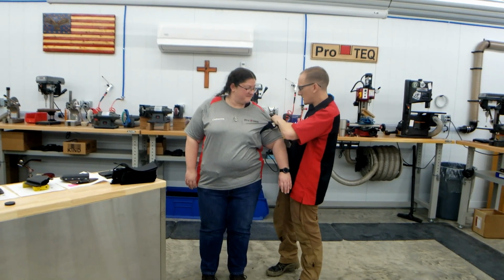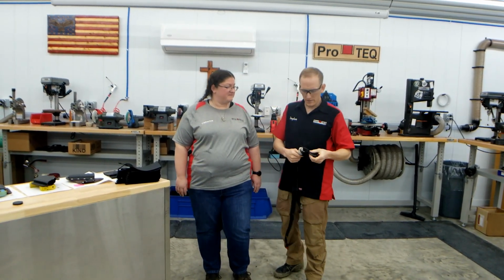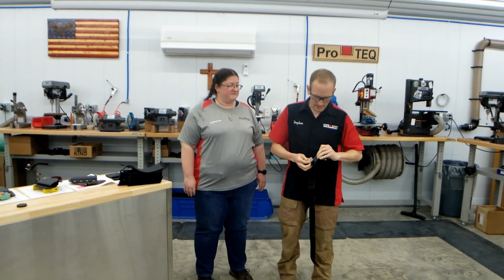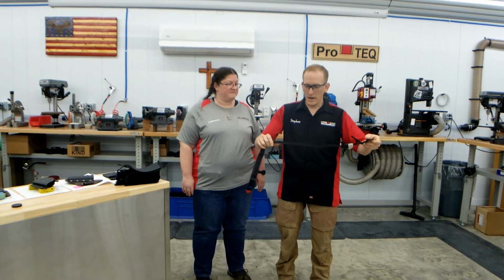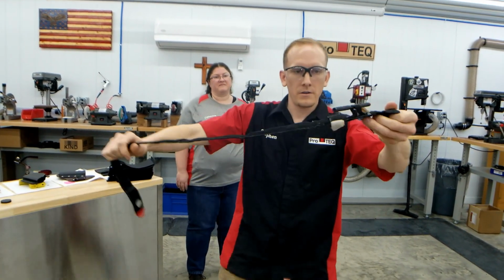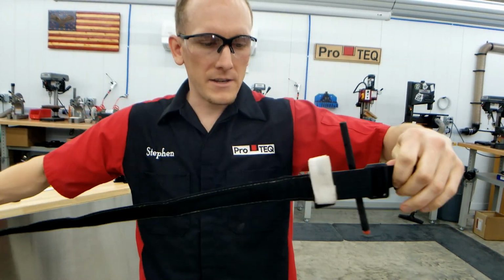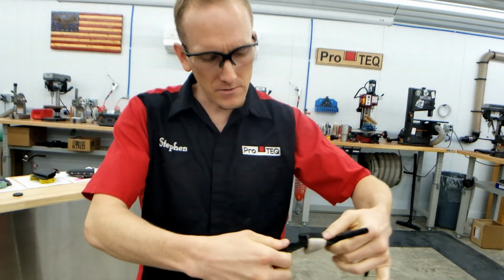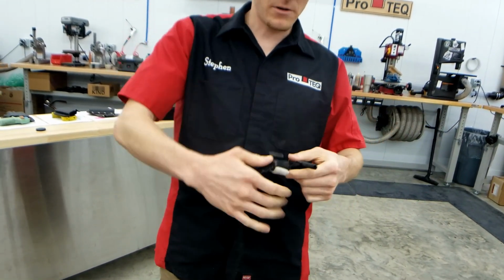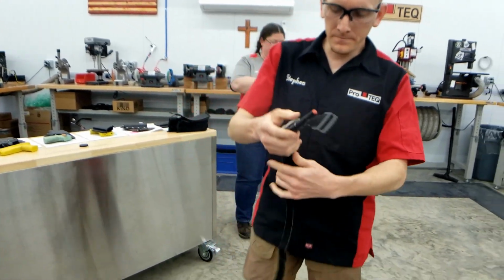And then I recommend you buy a few tourniquets and have a training one and then carry a prime time one. I just carry this one because it's easy and I'm using it all the time. But after you take it off, take it and stretch it. And watch this part here. See, that'll kind of bring that strap back down in there. Now that strap goes all the way down into this area, and you can get a lot of turns out of the windlass before you run out of strap.